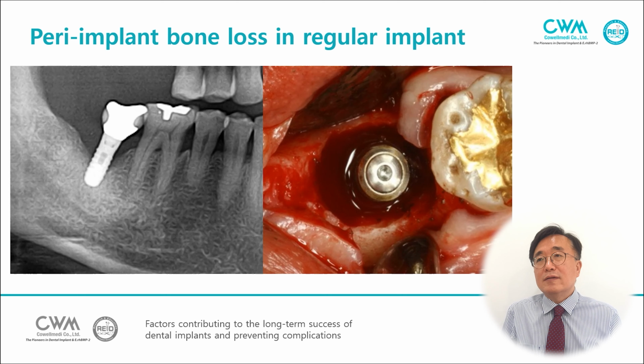In this regular size, regular diameter implant have peri-implant bone loss.